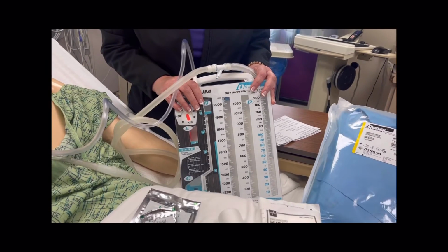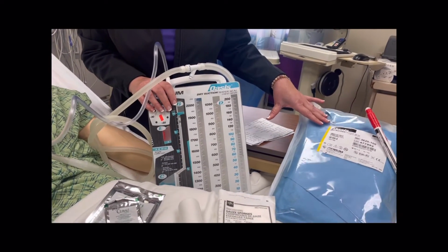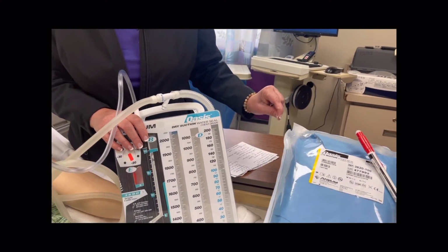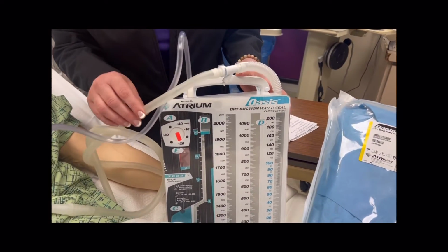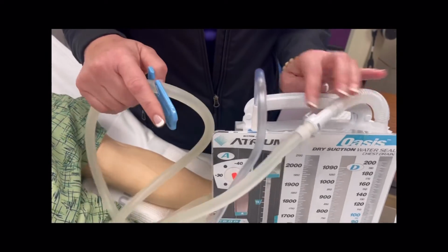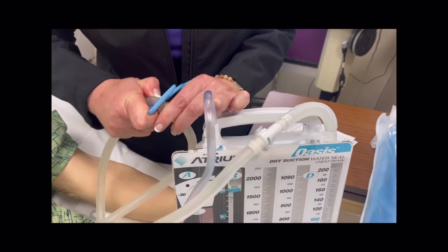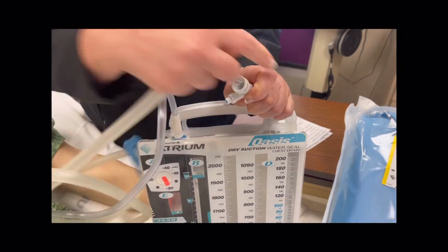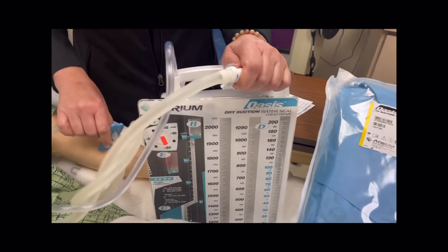Well, if it's full, we're gonna change it out. So you're gonna go ahead and get another drainage device. It needs to be the same, single to single or double to double. This is the one and only time you will ever clamp your chest tube in order to change out the device. So when we're doing the change, you would clamp it, disconnect it, and then just change to your new device. Then we'll say, this is my new device, connect it.